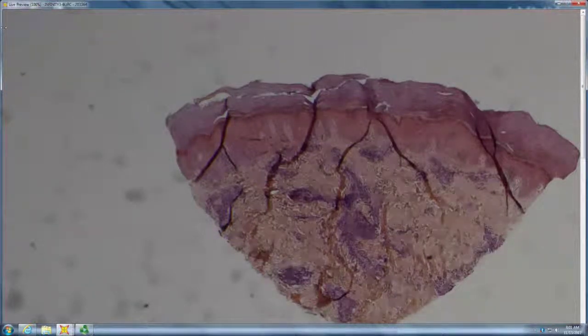So what would you call it? A segmental hyalinizing vasculopathy? Probably atrophie blanche. Yeah, exactly. So that's how it earns its name, because this is segmental hyalinizing. It's not a vasculitis, it's a vasculopathy. But the lumens get so small that the cells can't get through.